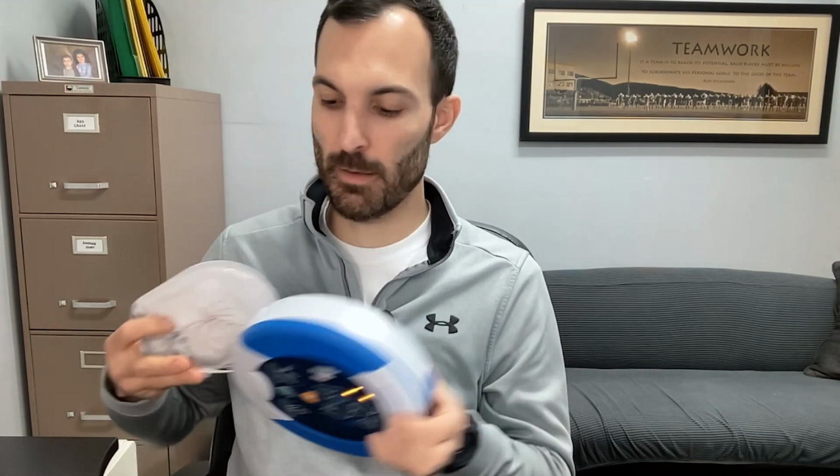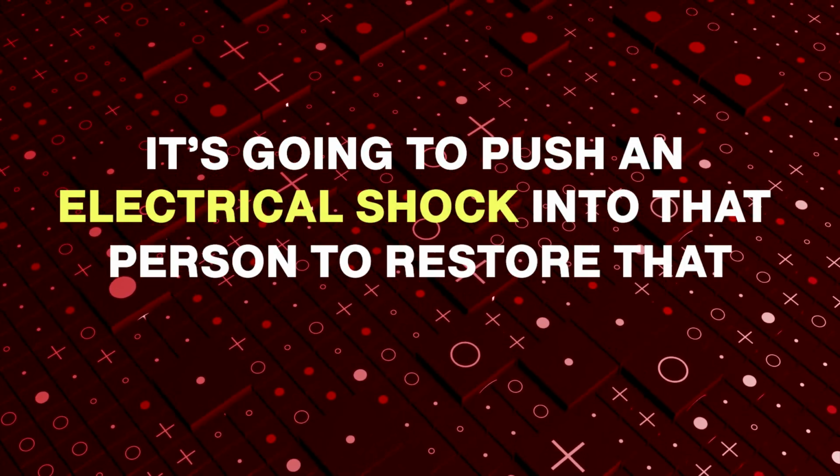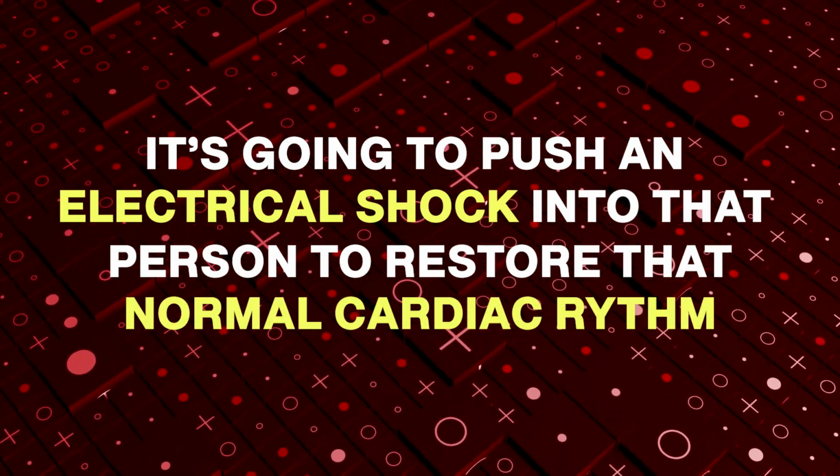And again, when a person's heart is experiencing a ventricular fibrillation or a pulseless ventricular tachycardia, it's going to push an electric shock into that person to help restore that normal cardiac rhythm. So that's how we want to use the AED machine. That's why they're so valuable and they're so important.